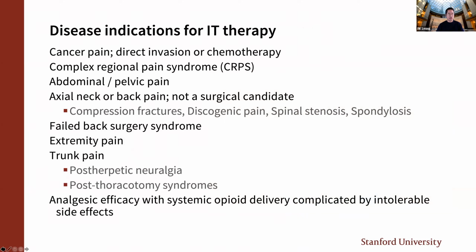And some of the indications for intrathecal therapy are what you would expect, like cancer pain that has metastasized. There is, believe it or not, a case series for complex regional pain syndrome, which I'll get to in just one moment, with one specific drug. But sometimes abdominal pains and pelvic pains don't respond as well to spinal cord stimulation all the time. And there are other kinds of pain conditions where you just don't get as much benefit with a kind of targeted focal stimulation pattern.